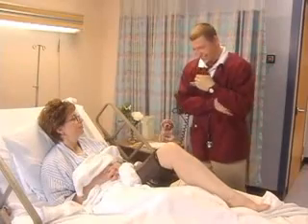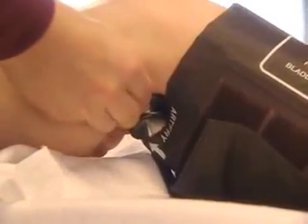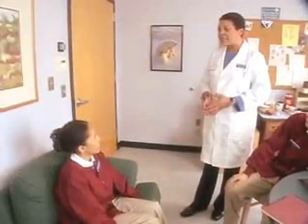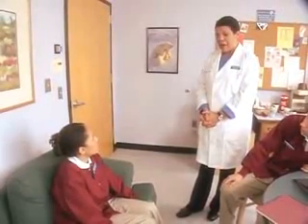Good. And Melissa, what's the procedure for taking a blood pressure on the thigh? Place the stethoscope behind the patient's knee using the popliteal pulse. Right, and just keep in mind that systolic readings in lower extremities are about 10 to 40 millimeters higher than the brachial sites, but diastolic pressure is about the same at either.